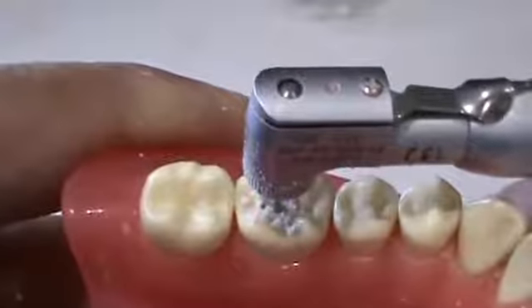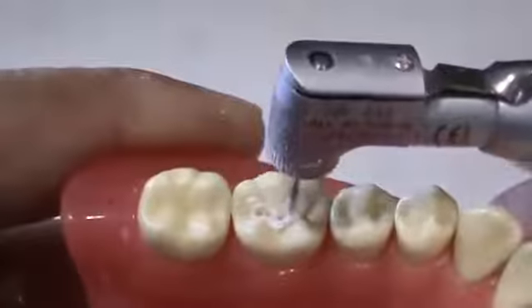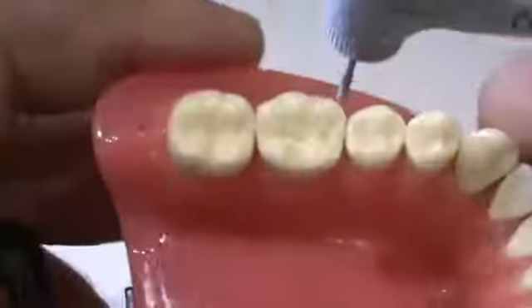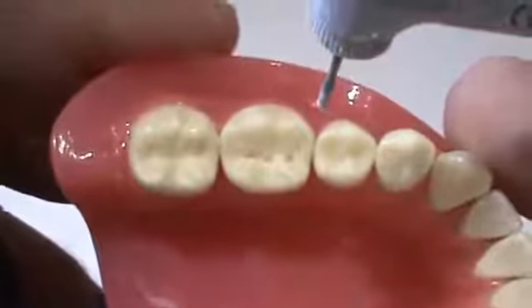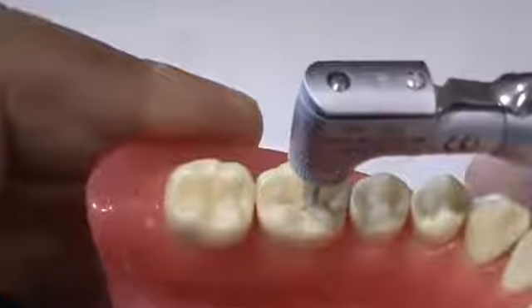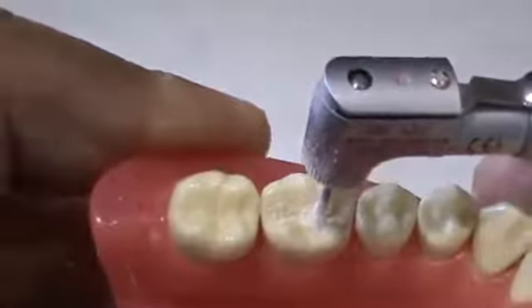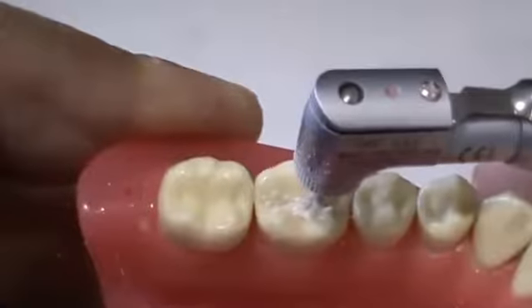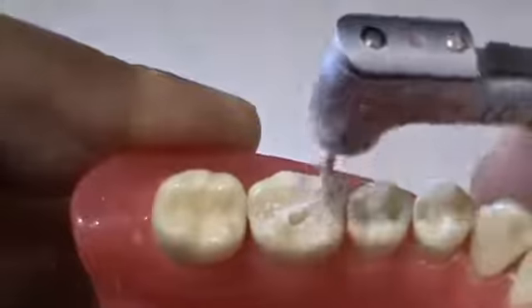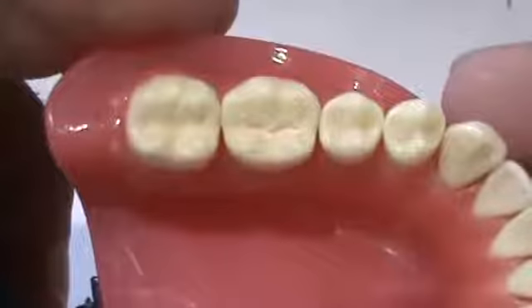No tilting is done during this phase of cutting. The burr should be upright or perpendicular to the occlusal plane. This is the initial outline of the cavity.